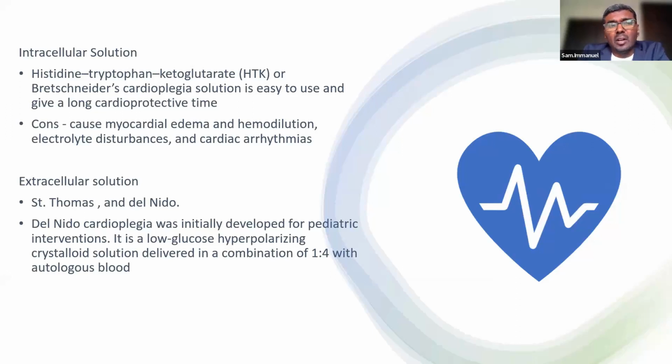And the main con over here, what I can say is, if at all the surgeon needs to repeat the cardioplegia, that is when we can see a lot of arrhythmias, a disturbance in your electrolytes, and hemodilution is very high because it is completely crystalloid, and the chances of myocardial edema are also higher because adding mannitol to your cardioplegia is again a debate here.